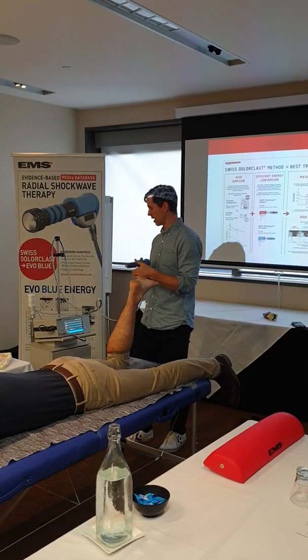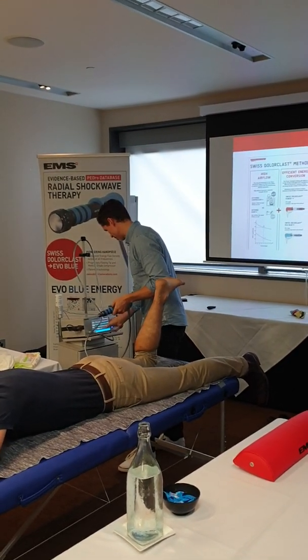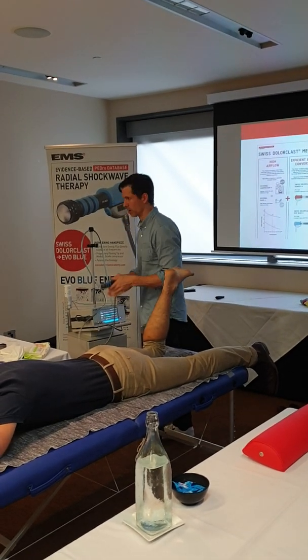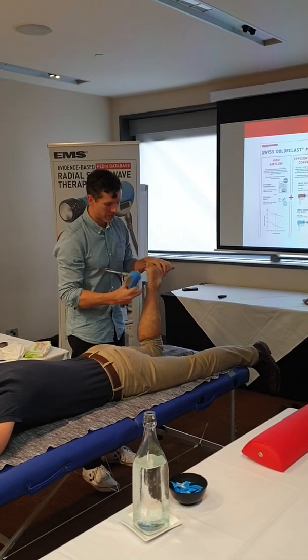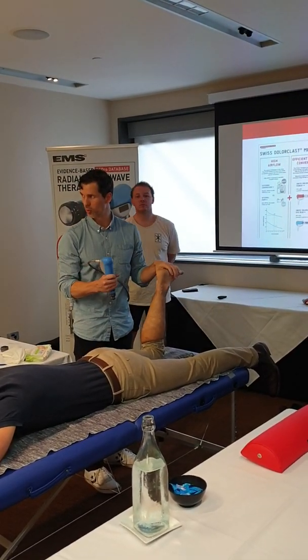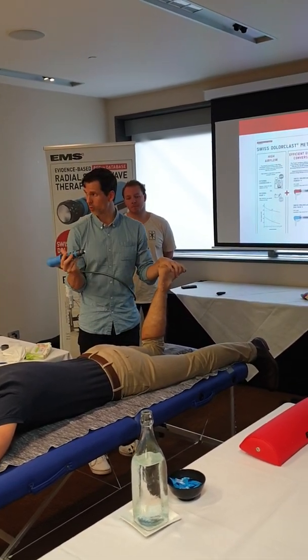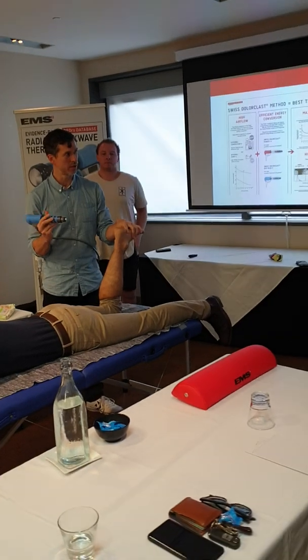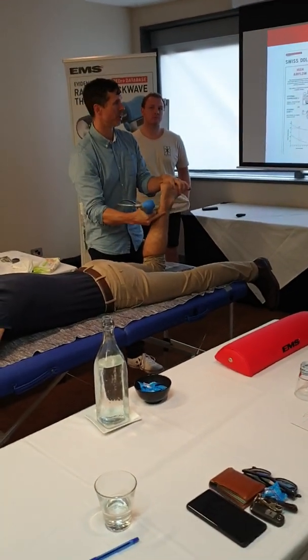We'll try on 1.5. I'm sure he'll be fine with that. That's not very high for an Achilles. So usually the Achilles tends to be worse on the medial side than lateral. Very few people do I find lateral more painful. But it also penetrates through, remember, because it goes 40 millimeters. So some people, when I do the lateral part, actually feel it more on the medial part.